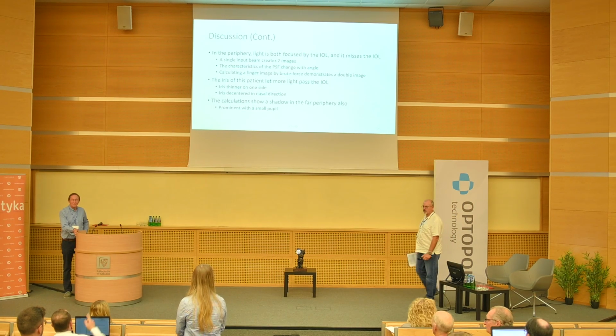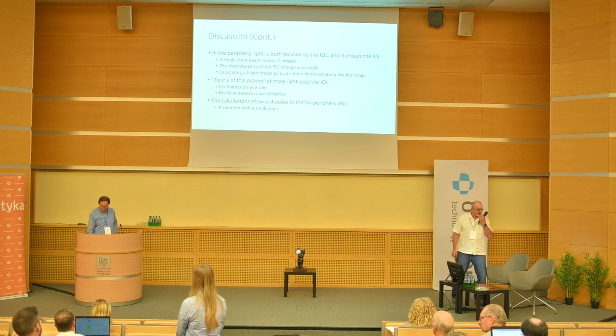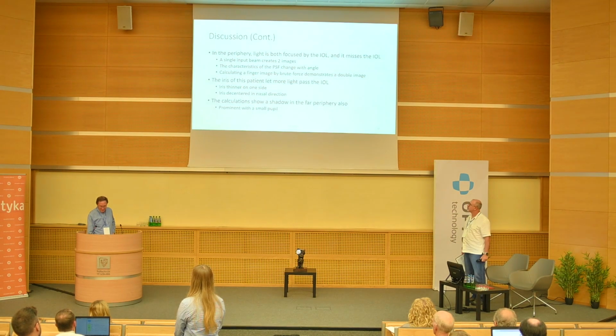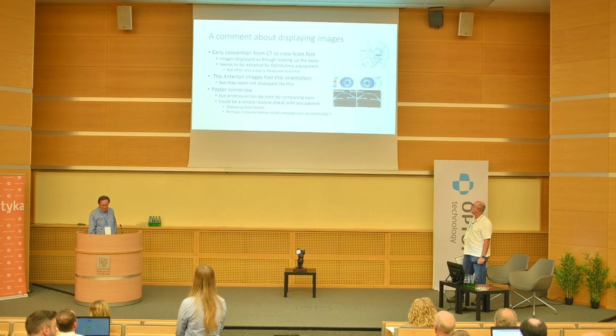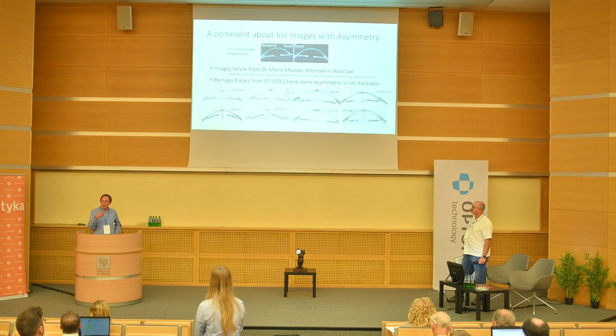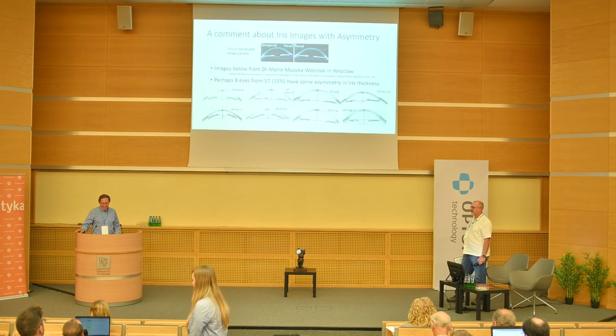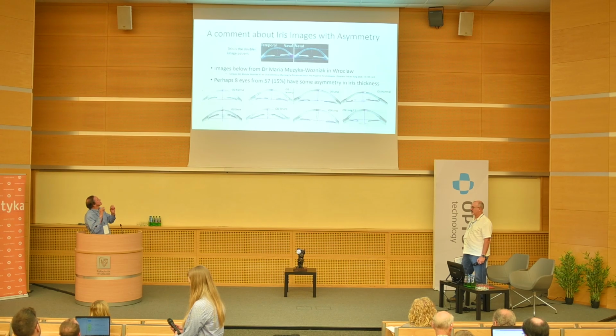In one of the last slides, you showed an OCT image, which was indicated as double OCT image. What does that mean? Previous slide, I think. Yeah, double image patient. It's this one actual patient who sees the double images. Oh, okay, thank you. Those are the images of those patients where you've got a very pronounced, you know, the iris is really thicker on one side.